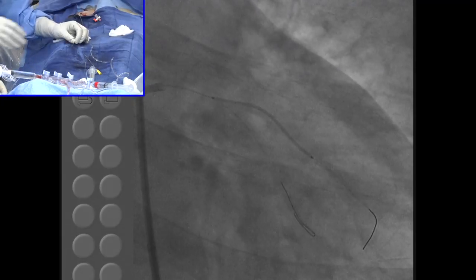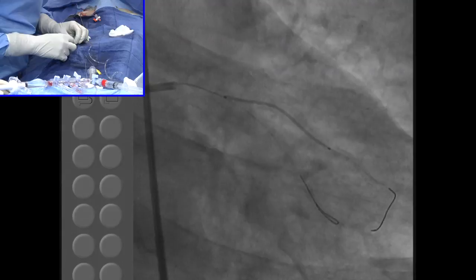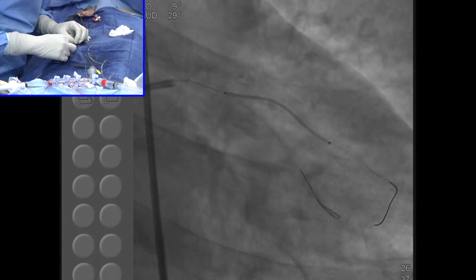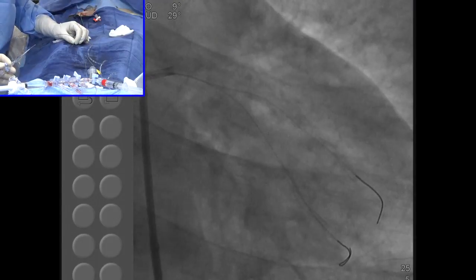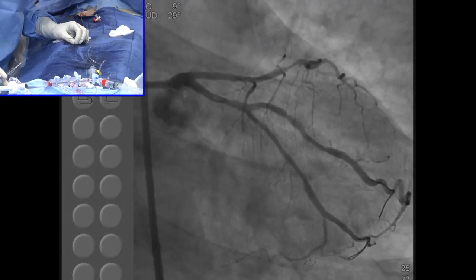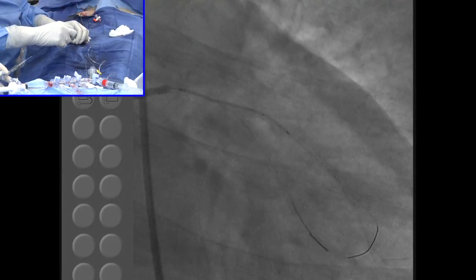Yeah, the floor. Let me take a cine and see if it's covered or not. You want to pull back and pull? I think you're just a few millimeters short. Yeah. No, but it can go a little bit in anyway if we are putting a second stent in the main vessel, in the OM2. So pull back again, you'll go back in again. Yeah. I think we need to cover here, and then we can take a 2.75, 80 is 16 or 20 for the OM2.